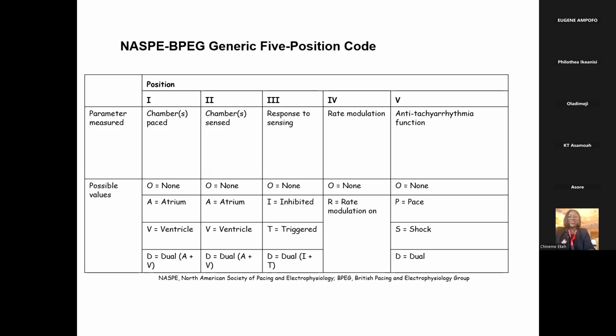system. So that defines the pacemaker mode. It's alphabetically arranged, and also it is categorized in Roman numeral from 1 to 5. So for the first alphabet, it clarifies the chamber that is being paced. So the parameter is well annotated here. Chamber paced, which is the first alphabet.